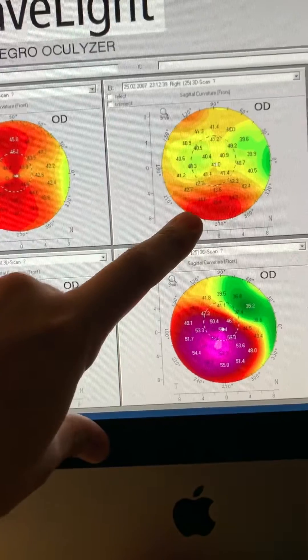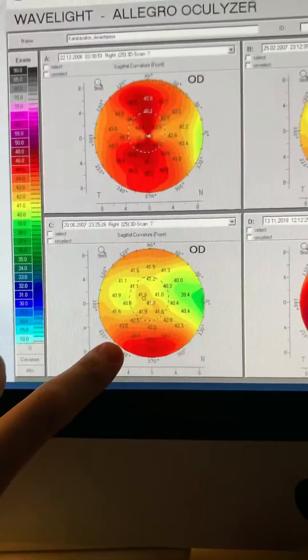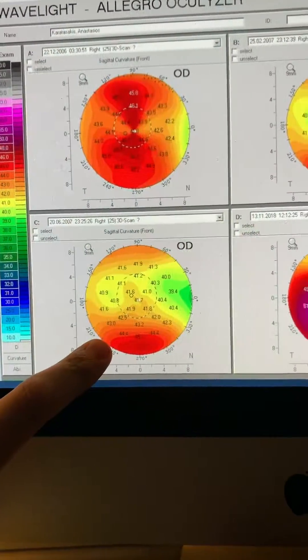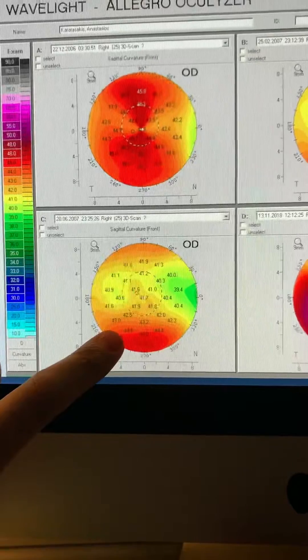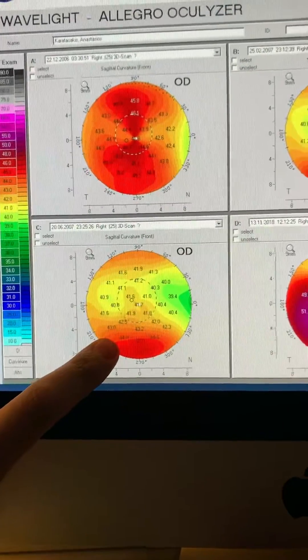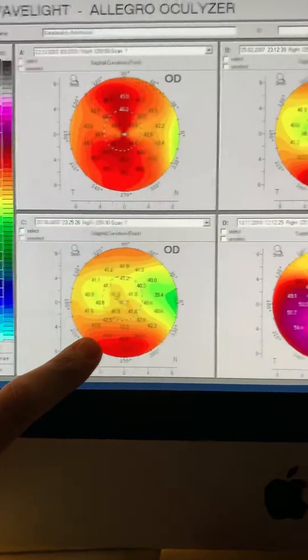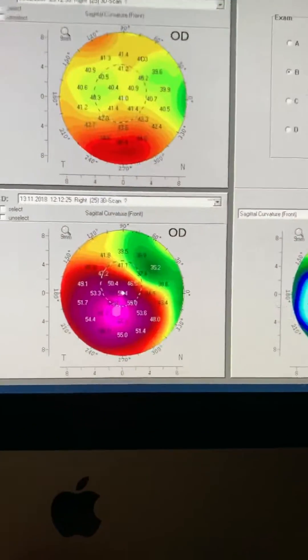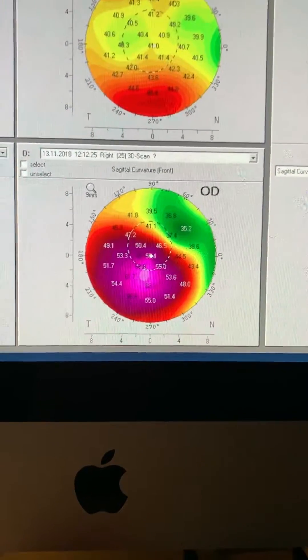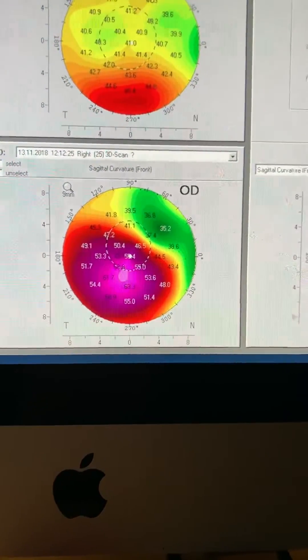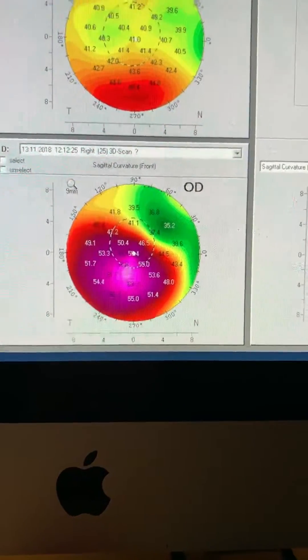2007 some mild irregularity. Surprisingly, within that same year later, stable. We lose contact with the patient for almost 11 years, and he presents this week with this image here, overt ectasia.